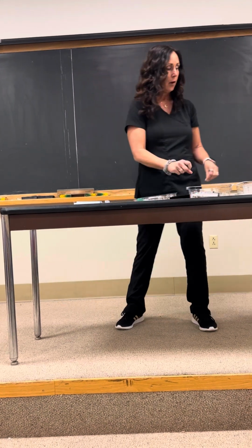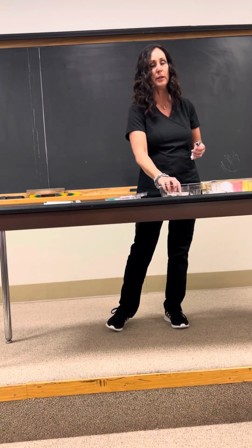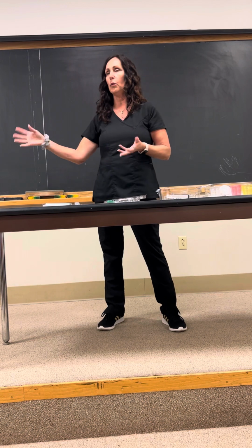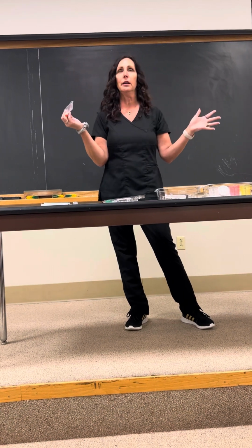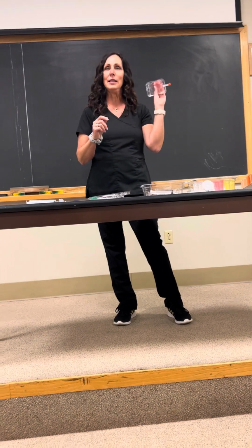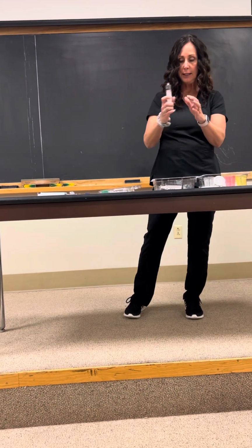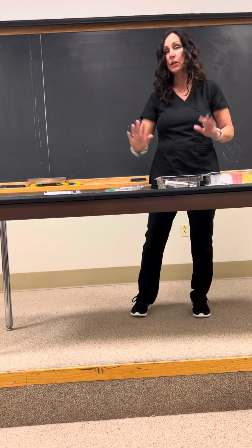Once that's done, we will load the syringes with the actual anticoagulant that's going to be used for the marrow draw. We don't actually use heparin as the anticoagulant because it has a tendency to drive stem cells down the pathway of becoming adipocytes or fat cells versus bone. We want it to become bone. So we use ACDA, which is a standard anticoagulant in any kit for PRP. It's what they use in blood banking for an anticoagulant. This is going to get decanted onto the field. They're going to give you about 10 cc's of it, and all you're going to do is load each of these with 5 mLs of ACDA. And then that's all ready to go.